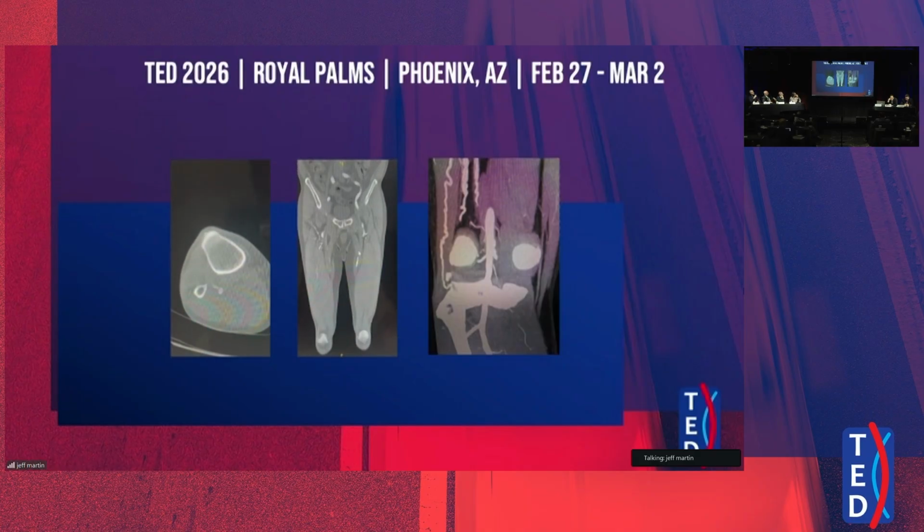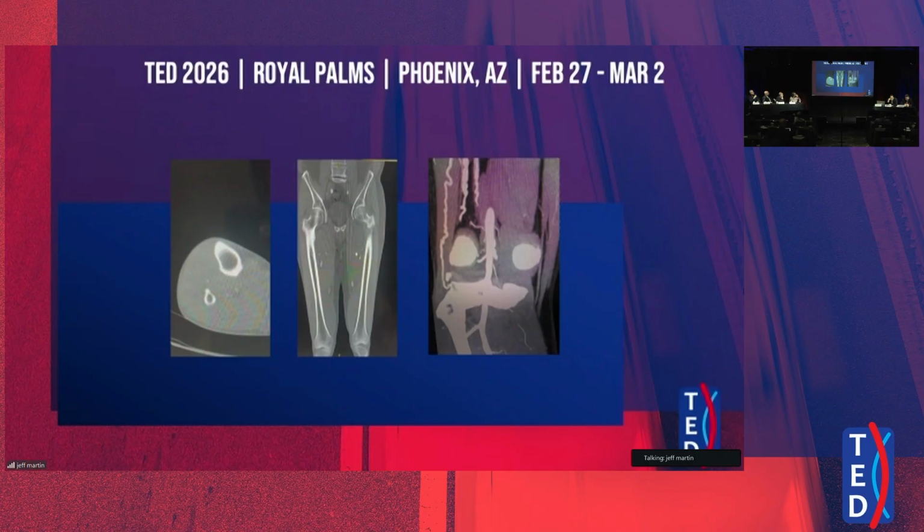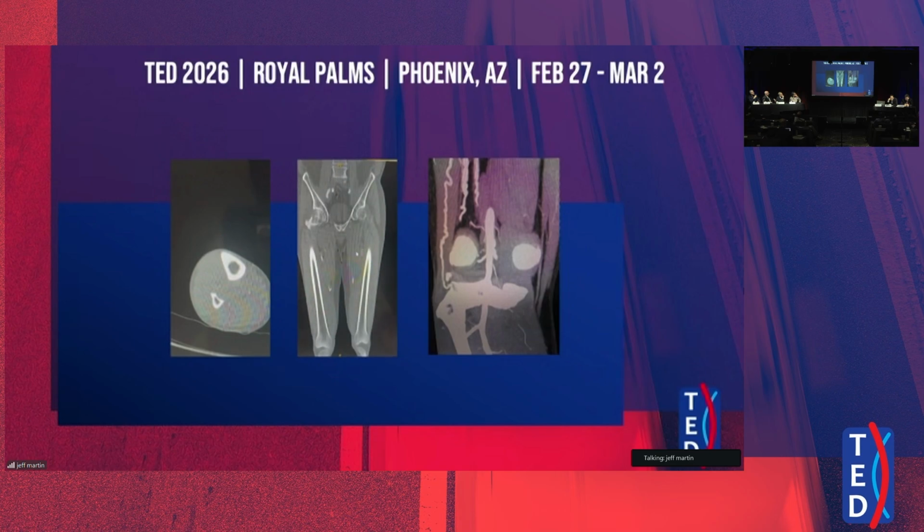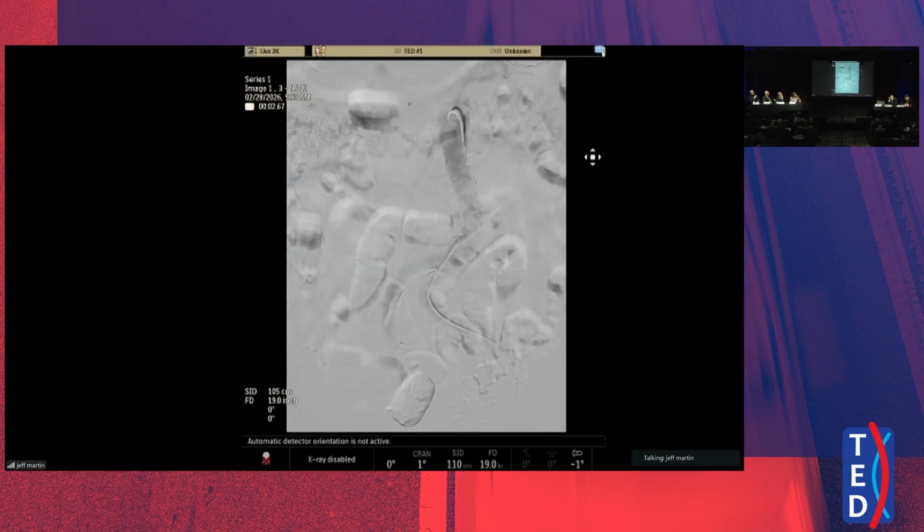Sometimes the reason I'm presenting this is we had a challenge, which is pretty nice to do, and I think Dr. Golzar touched upon this. As you can see, the distal SFA popliteal reconstitutes P1 and P2 segments, so the whole artery is completely occluded. So we went up and over today and did an angiogram, and you can focus on the TV camera. There it is.